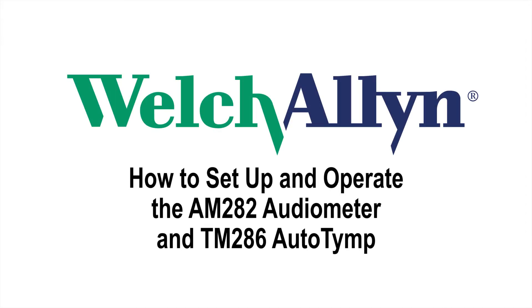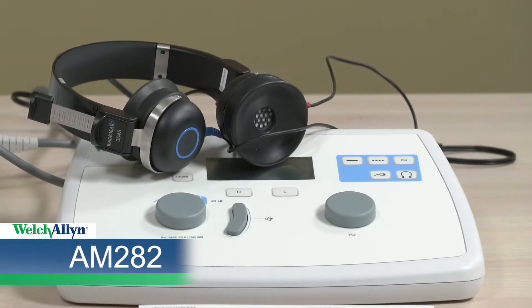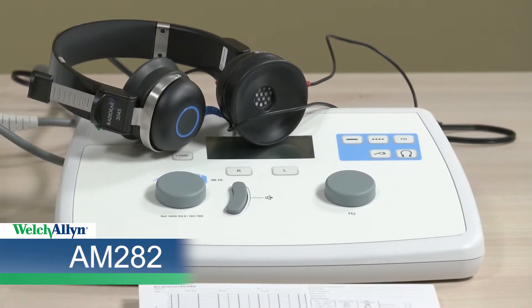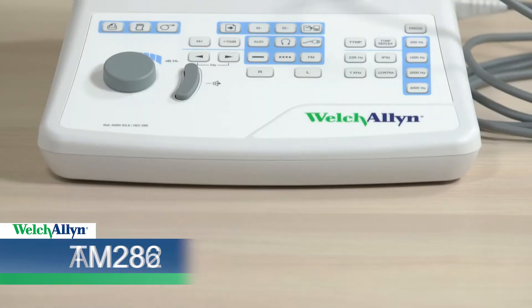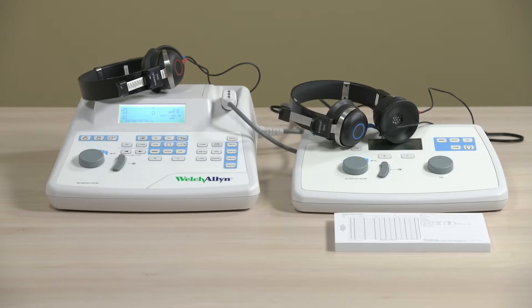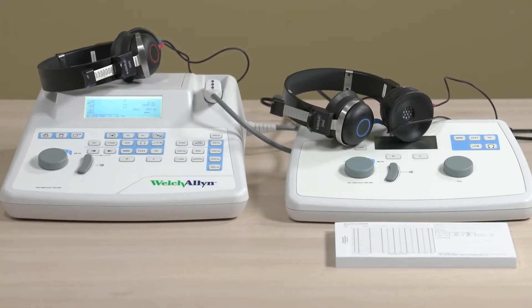Today we'll be reviewing how to set up and operate two Welch Allyn devices for screening the ear. The Welch Allyn AM282 Audiometer is a single channel, pure tone, air conduction instrument designed to provide basic audiometric screening. The Welch Allyn TM286 AutoTymp is a versatile combination instrument that provides testing capability for tympanometry alone, tympanometry combined with screening acoustic reflex measurements, and screening audiometry. Testing with both devices is easy to learn once you understand each of the device buttons and what they do.